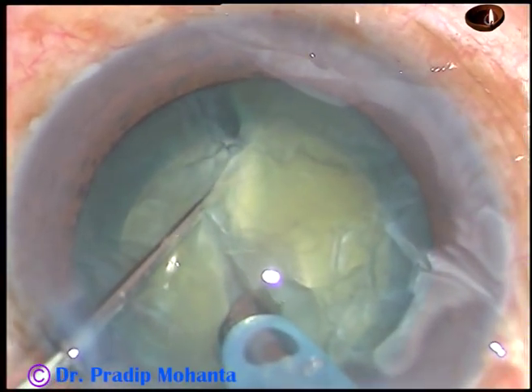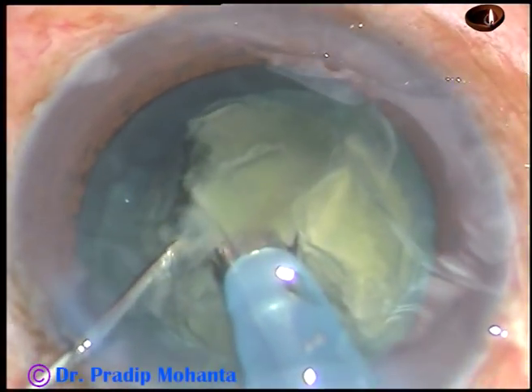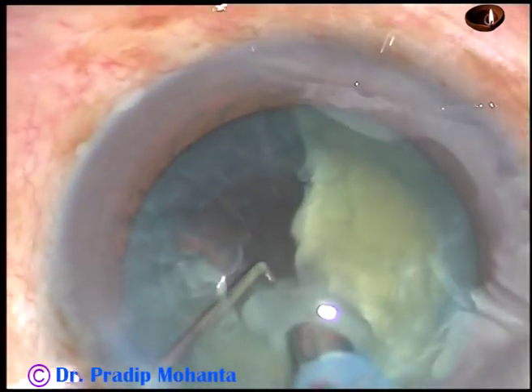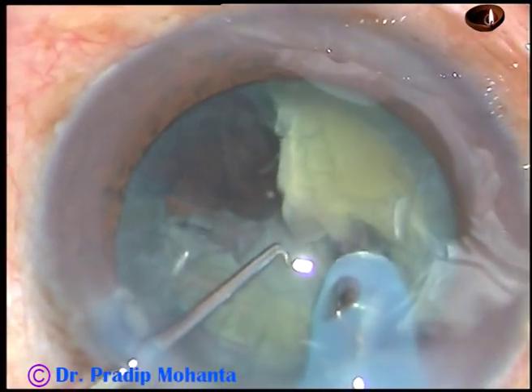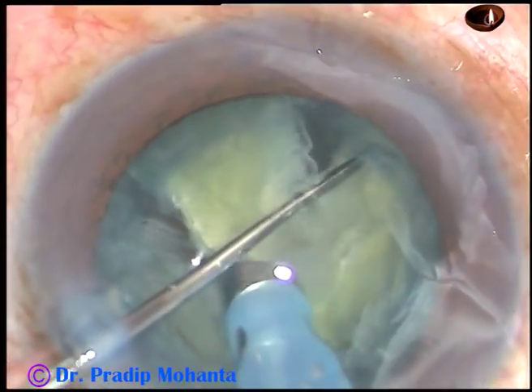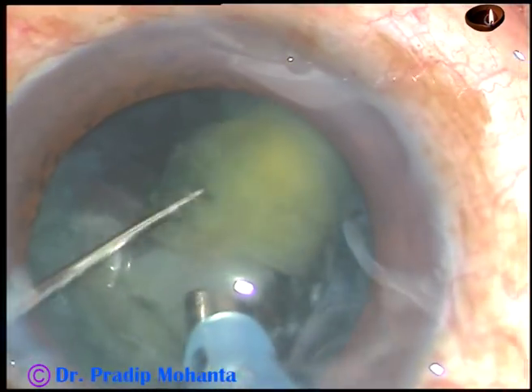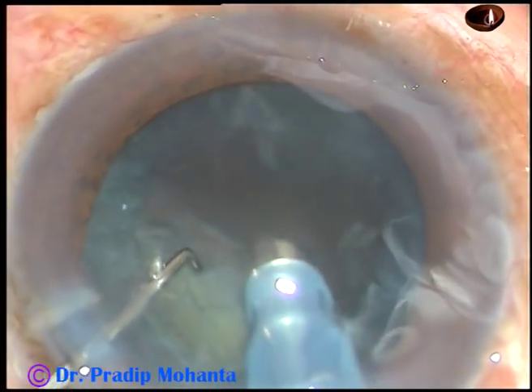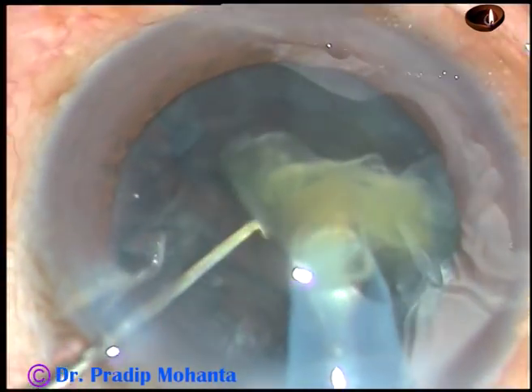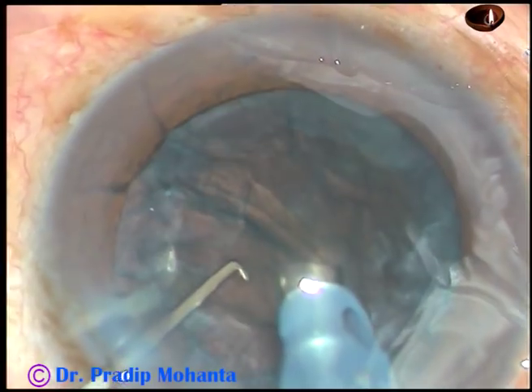Now turn the FACO tip towards 3 o'clock and make another groove. This nuclear fragment is now free — emulsify it. At this time, inside-out hydro is occurring. Turn the tip towards 9 o'clock, hold it very firmly, and make another groove. This is another big nuclear fragment — emulsify and remove it. Now see what happens: this fragment is also free. By this time, enough natural hydrodissection has occurred, as Dr. Narayan Bhardalui calls it, and the nuclear pieces rotate.